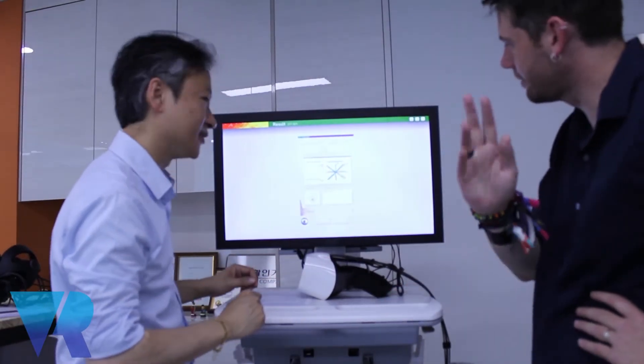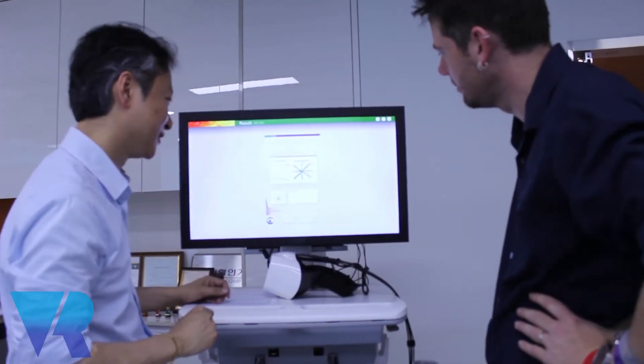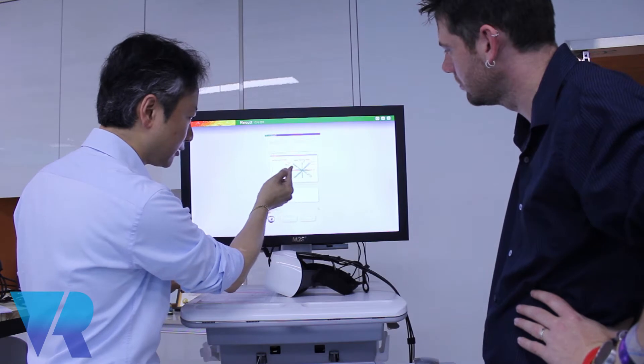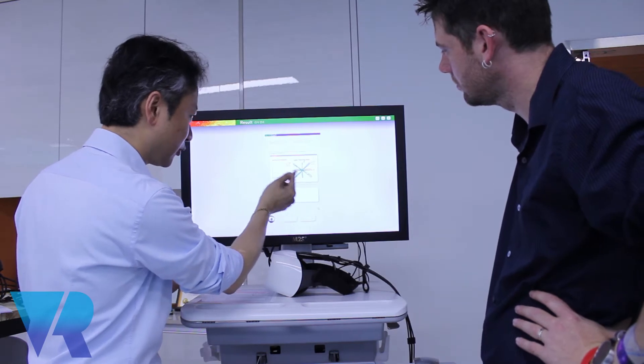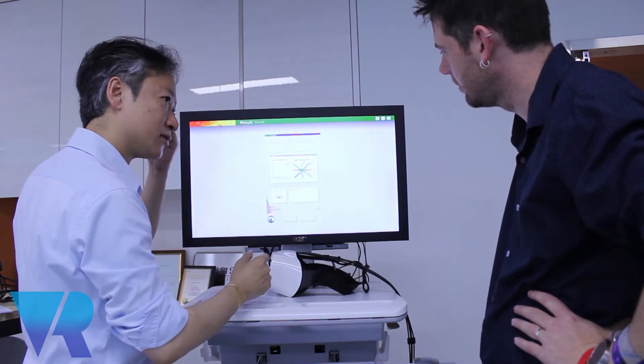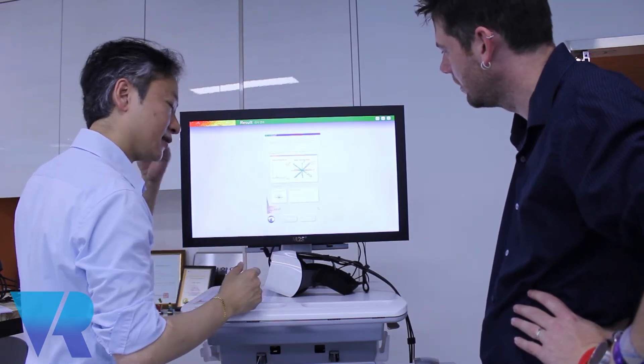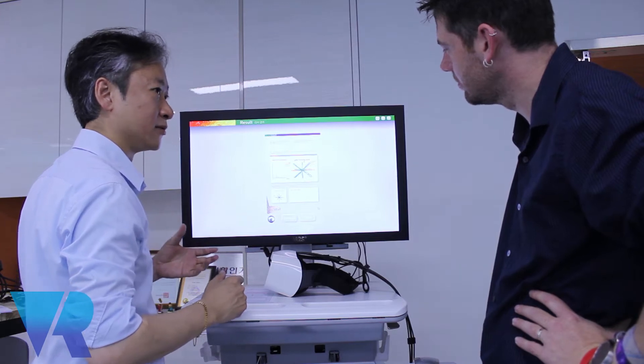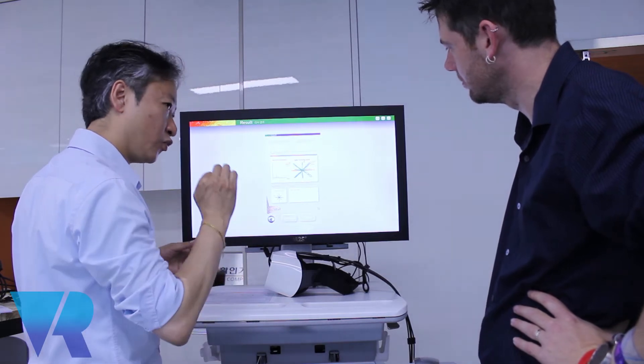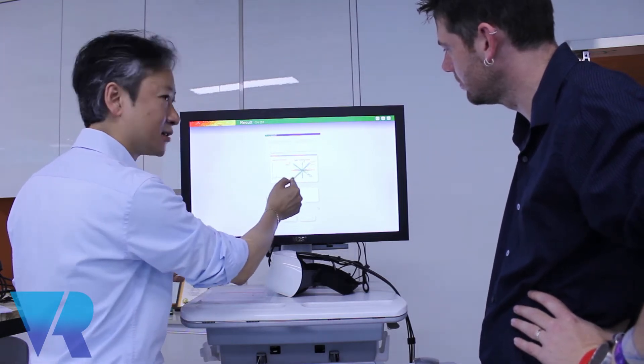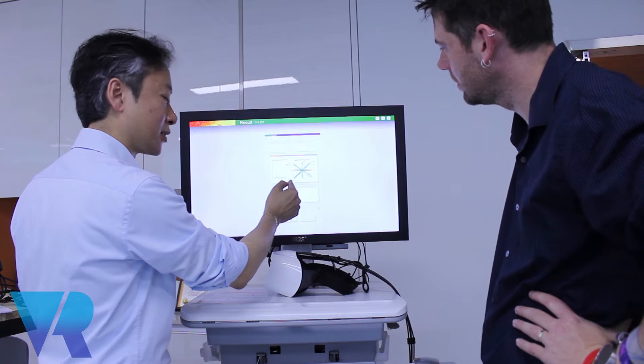So moving this side was my weakest, exactly, to my left. If they are moving like sideways, I see, trembling, then there is some problem with the muscle too. Weakened muscle even though they reach to the target.